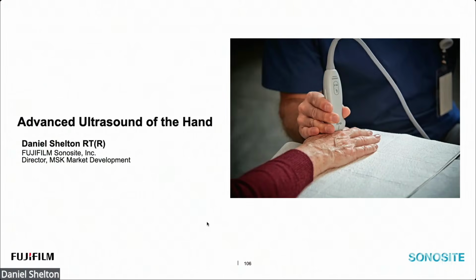The live scan was pre-recorded and cut and diced to avoid any unnecessary time, basically switching transducers or long gaps between audio, things like that have all been trimmed out to maximize content because we have a lot to go through. So I apologize for something that may seem fast, but this is mostly a reference for you also, and the full content will be put on the Sonosite Learning Institute in the future.